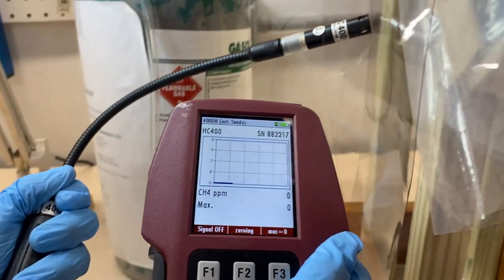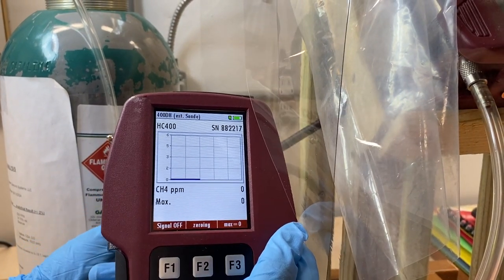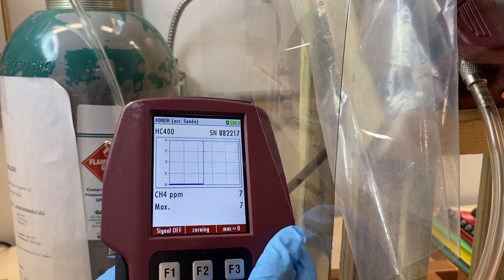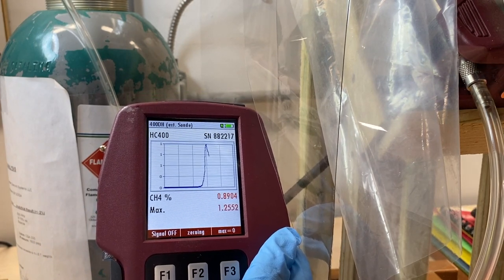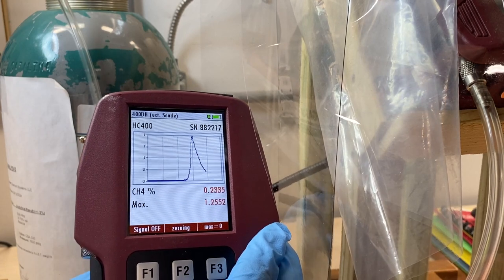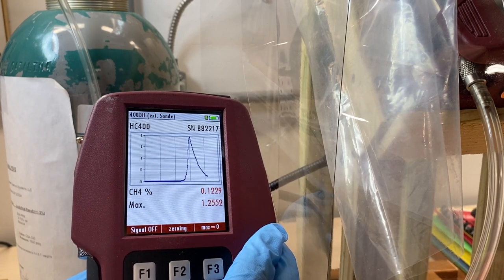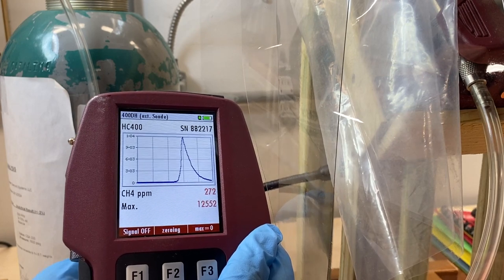The model number of the sensor and its serial number will display at the top of the window. A graph will display with the x-axis associated with real-time and the y-axis with methane concentration. The methane concentration readings are also displayed as a numerical value beneath the graph.